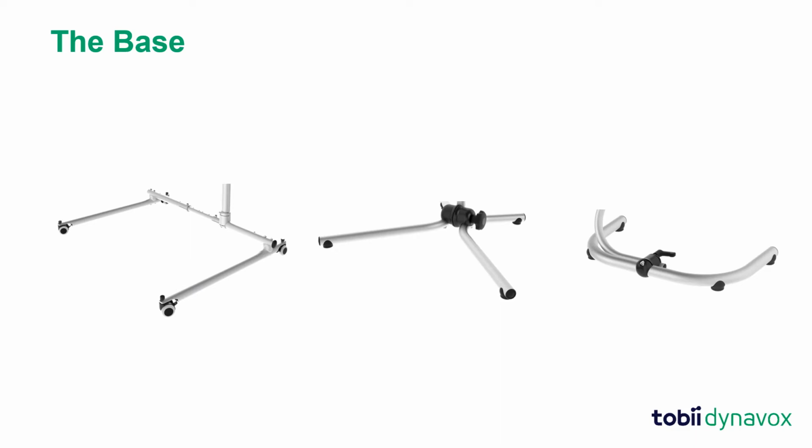Let's start by discussing the base for a mount. For a floor or table mount, the base provides a foundation for support, portability, and flexibility. The base of a floor mount can be stationary or able to roll into position for convenience. The base of a table mount can be small for smaller devices or wider and more sturdy for heavier devices. They can also fold quickly for easy storage and portability.